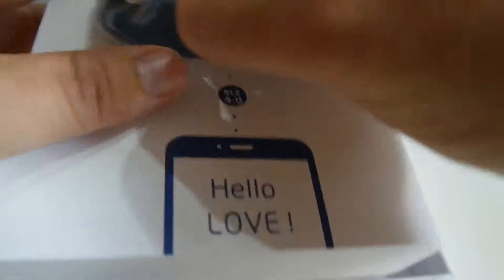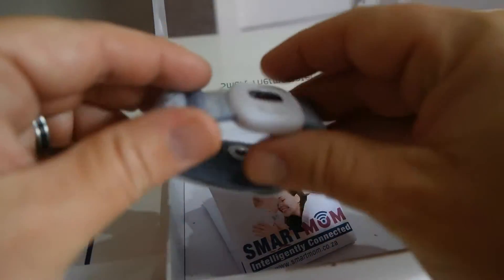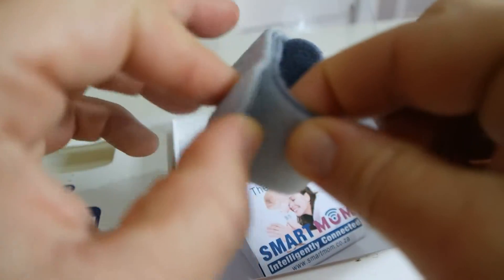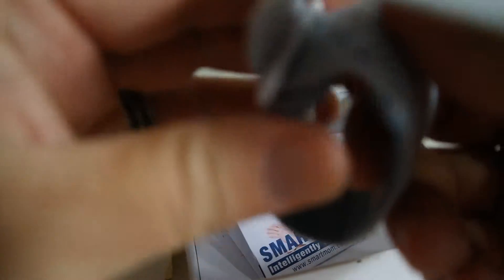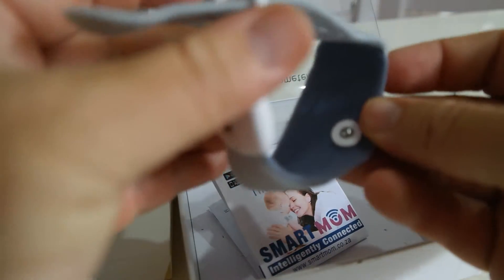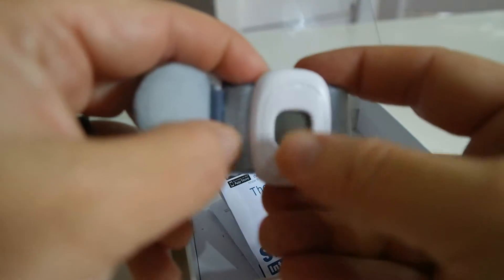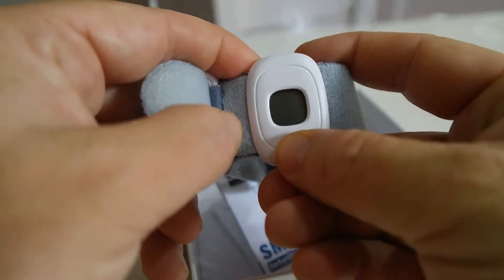Here's the thermometer — let's take it out. It's very small, obviously, because it's going to be used for a child. There's a nice soft velcro armband that can open up quite a bit. And there's your thermometer with a screen so you can see the temperature directly on it.